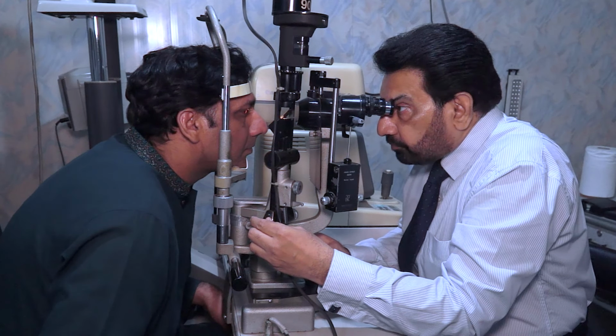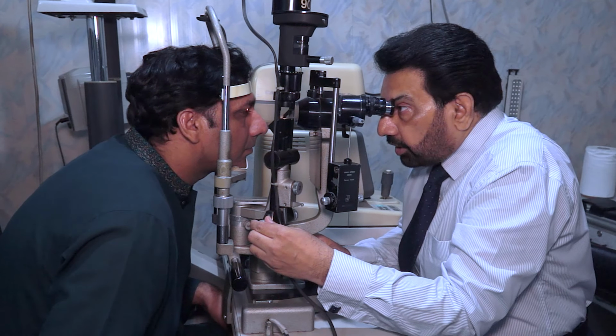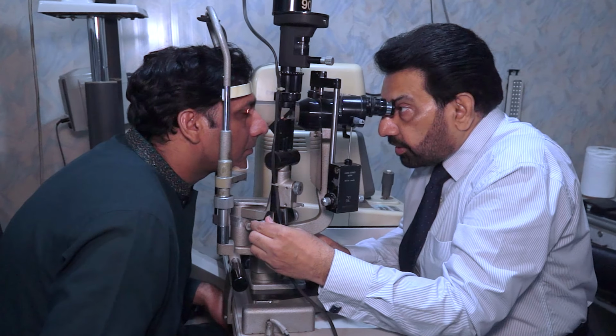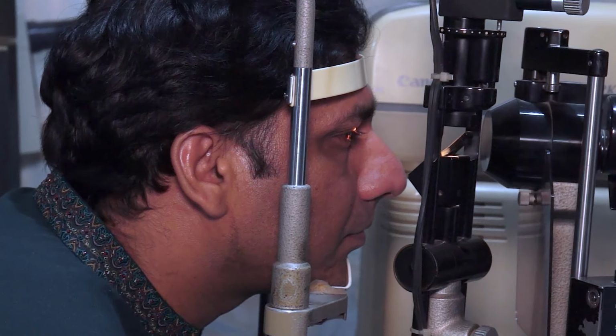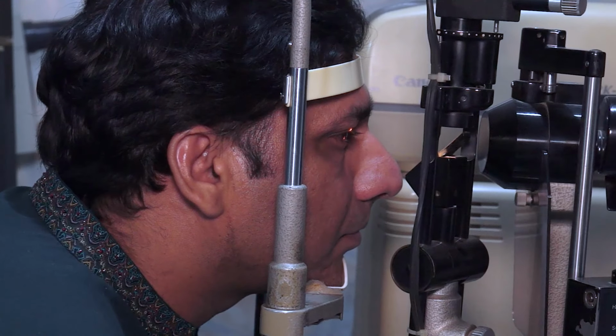For example, if there is any opacity in the cornea, we can measure the opacity of the cornea in detail, and also examine the other structures in detail.